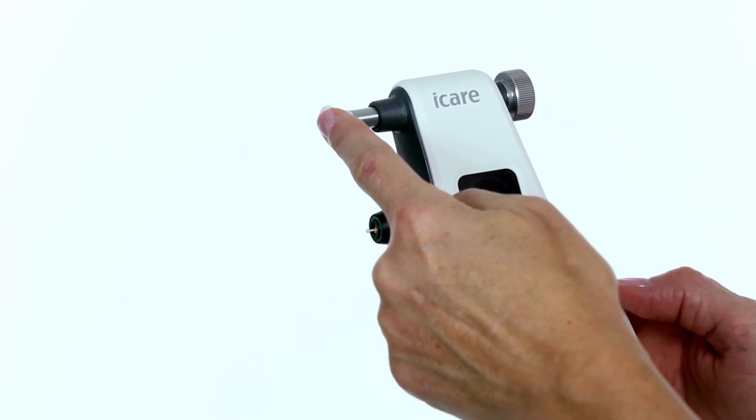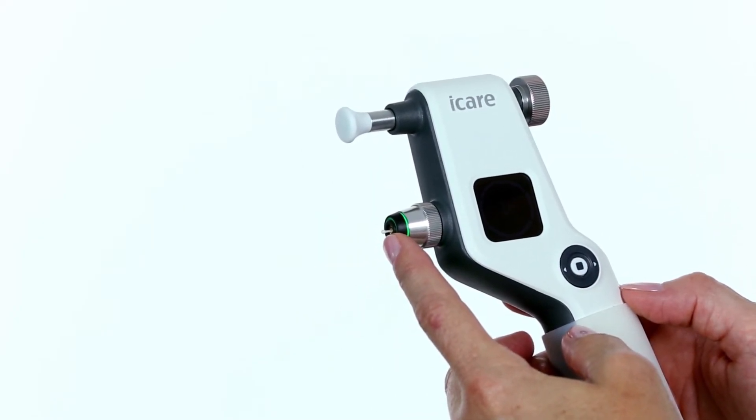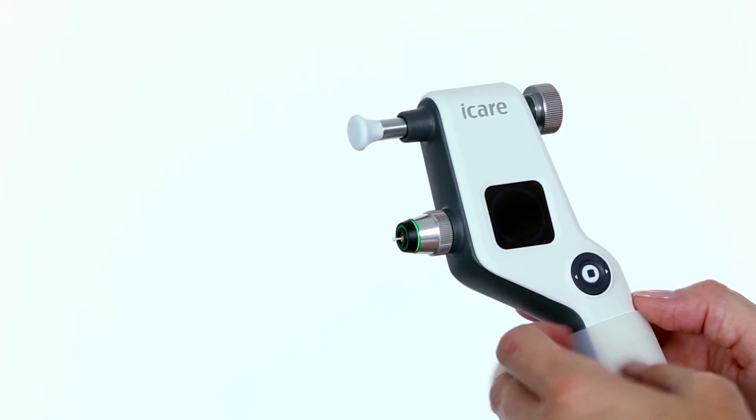Place the forehead support on the patient's forehead. Aim the probe in the center of eye. The distance of the probe to the cornea should be four to eight millimeters.